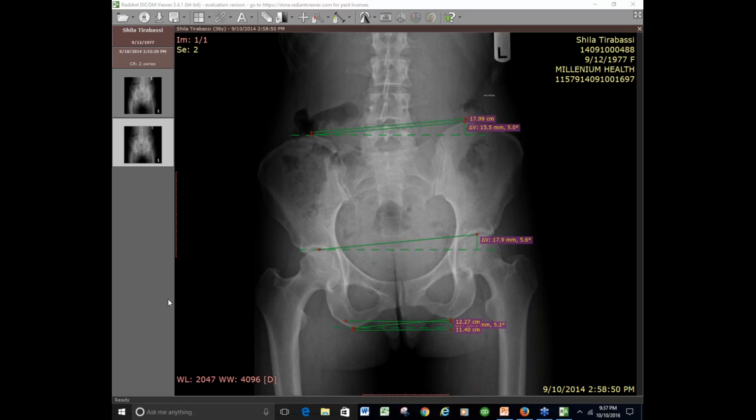And Greg, how you doing? Hello. Hey, Randy. Yes. Question. Regarding the setup for the film, are you going to get into more detail on that? Yes, I am. Good, because I could see where if there was a rotation of one ilium forward, how that would change things as well. Yes. So we are absolutely going to get into that. Great. You're kind of leading me into my next part of my discussion. It's a segue. Well, thank you. It's nice to have a plant out there. Thank you. So, all right.